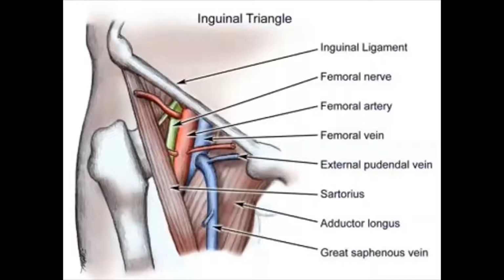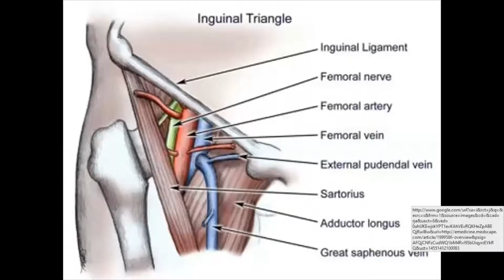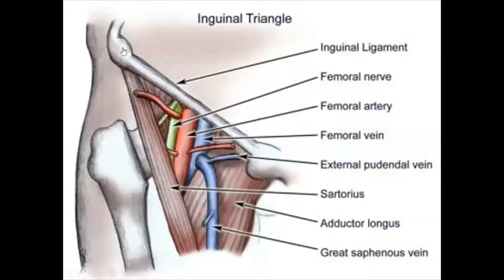So looking at the femoral anatomy, I'm sure you're all familiar with the anatomy of the femoral artery, where you actually gain access. The femoral pulse, where you feel it, is at the midpoint between the anterior superior iliac spine here and the pubic symphysis, and you have the famous structure, the femoral vein, artery, and nerve. And what you need to do is puncture the femoral artery here, not high up here, and not further low here. And there are reasons for that.